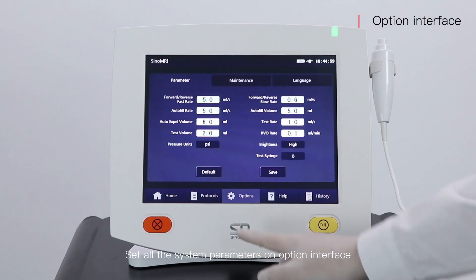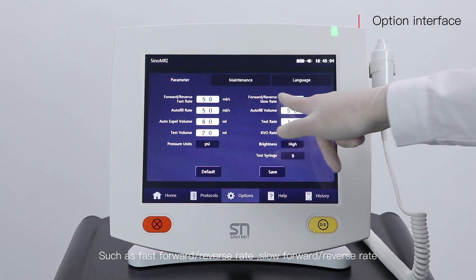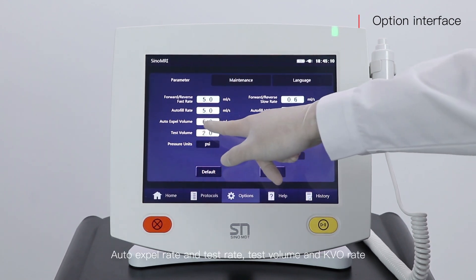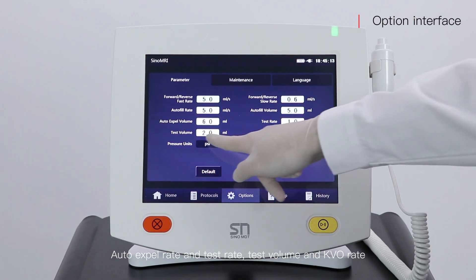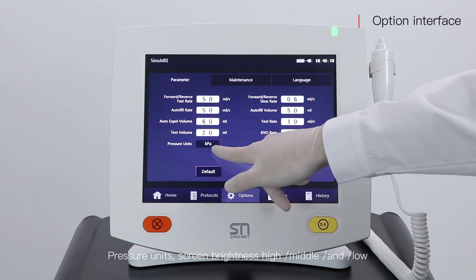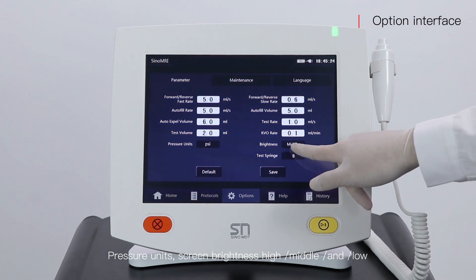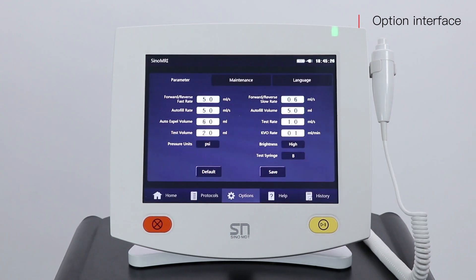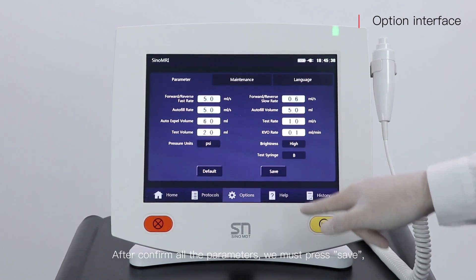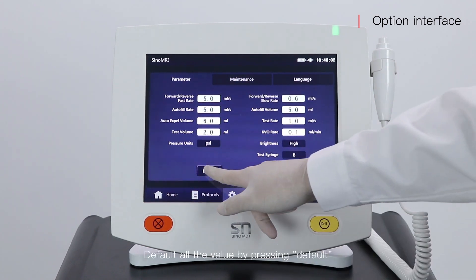Set all the system parameters on the options interface, such as fast forward/reverse rate, slow forward/reverse rate, auto fill rate and volume, auto expel rate and test rate, test volume and KVO rate, pressure unit, screen brightness (high, middle, and low), and test syringe set A or B. After confirming all parameters, press save. Press default to reset all values to default.